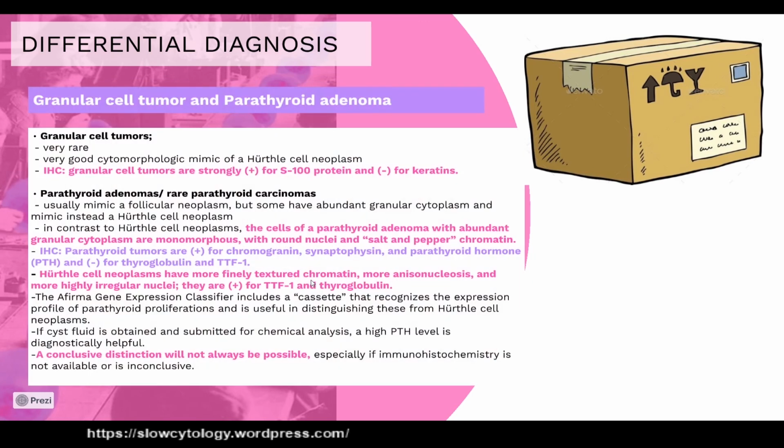Granular cell tumor and parathyroid adenoma are both on the differential diagnosis list. Morphology alone cannot help to differentiate these lesions, but immunohistochemistry may help with a conclusive distinction.